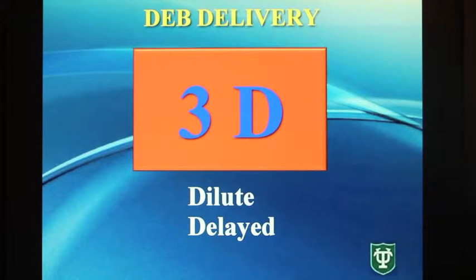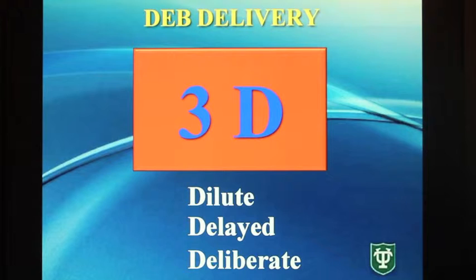It suggests that you do a milliliter per minute or slower and then wait after the injection, and of course it's deliberate. We make sure that we're doing it precisely each time, and we watch what we do, and when we're done we wait and see if there is any increase in the amount of flow.